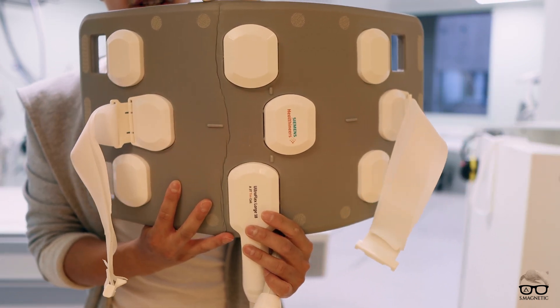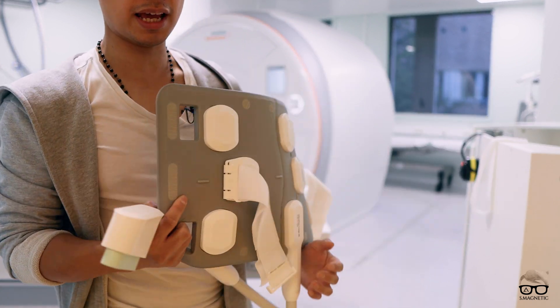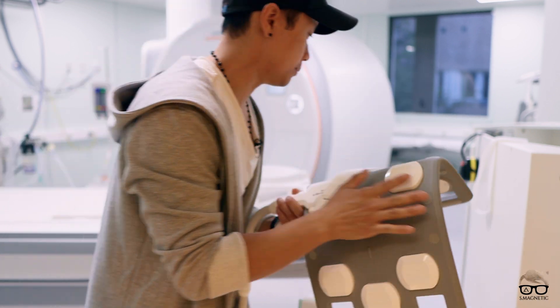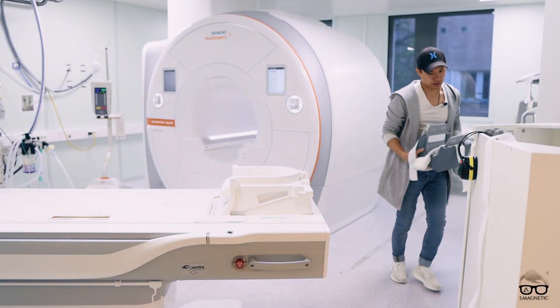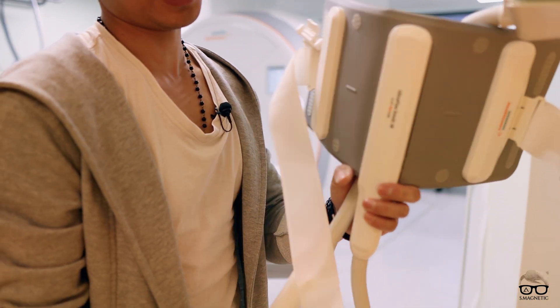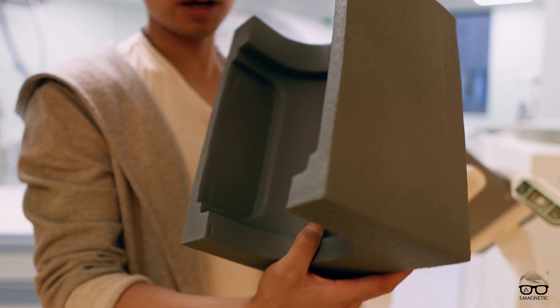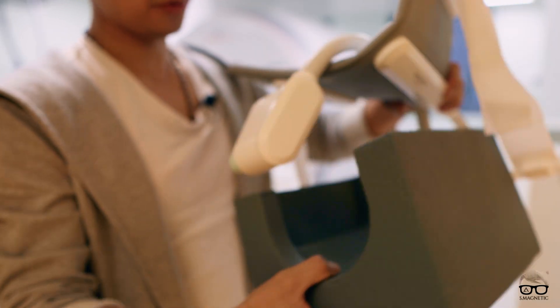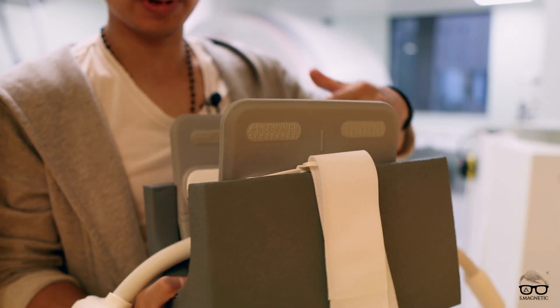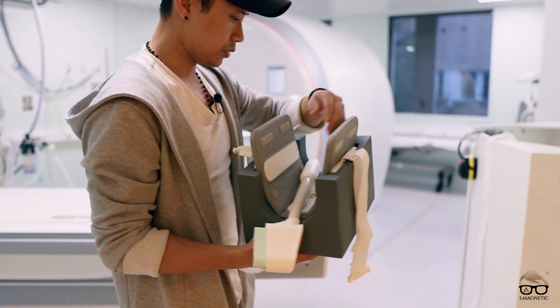Another coil which is very cool is this Ultra Flex coil right here — 18 channels, very flexible. You can flex it around the arms, elbows, whatever you want, and also the knee. And there's also another Ultra Flex, also 18 channels, very dedicated but a small one. Of course it comes with these kinds of cushions so you can wrap it around. It's very easy to use and it's flexible.